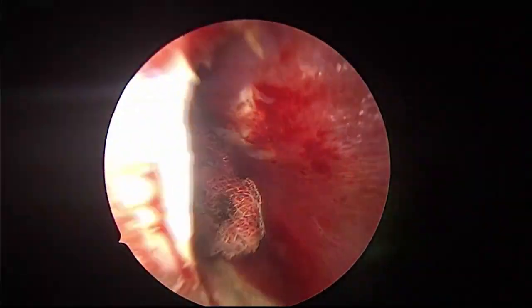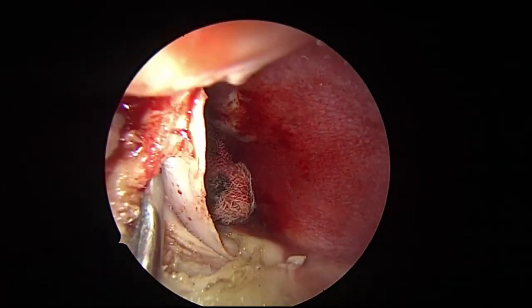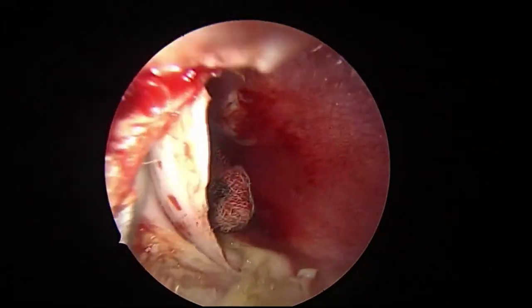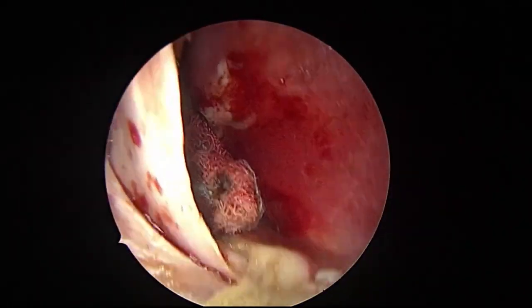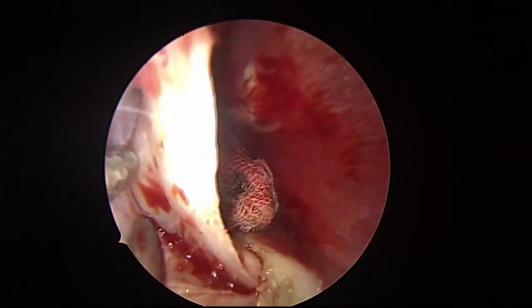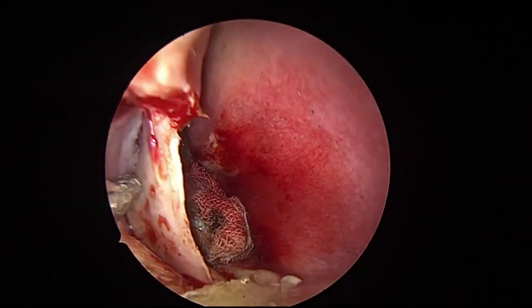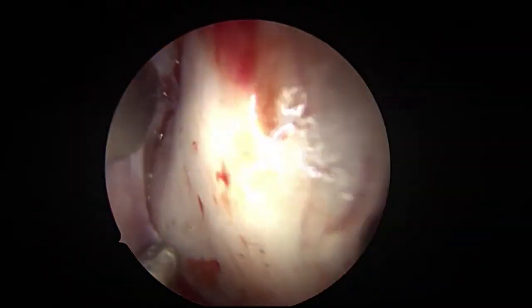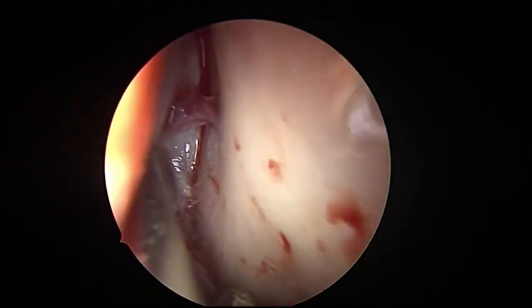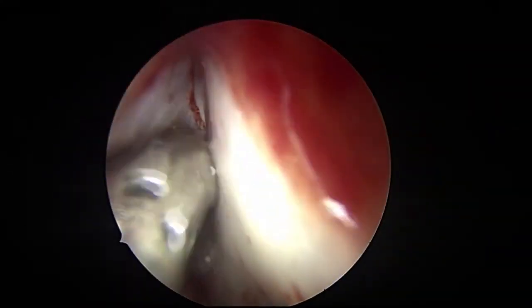Now I will come to the anterolateral wall. See how the coagulator expedites your procedure. See the subperiosteal plane. This is the anterolateral wall. What is this? Anybody? Anterior superior alveolar. Yes. Anterior superior alveolar neurovascular bundle. See this? Yes, sir.